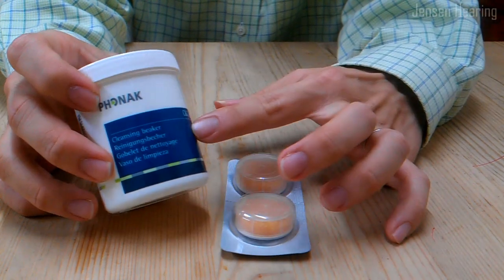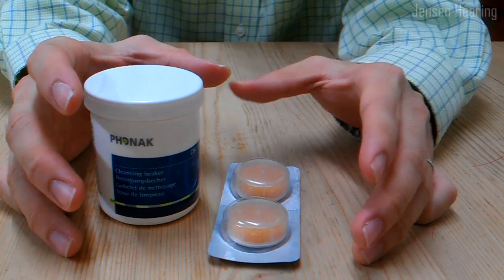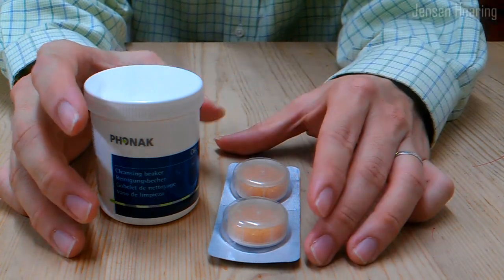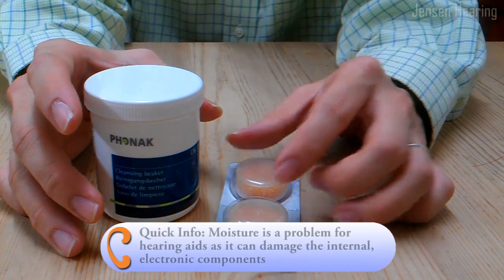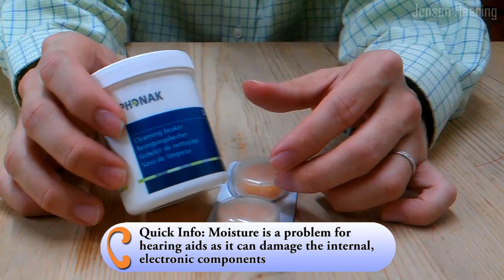We have before us a drying beaker and some drying capsules. These are used to preserve the hearing aid so that it lasts longer and prevents moisture damage. These are passive drying agents.